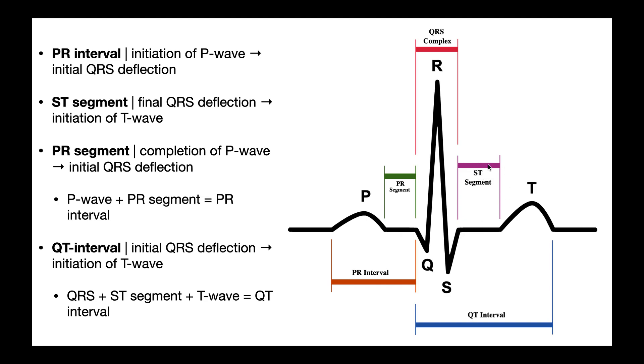Then we have in purple the ST segment. The ST segment starts at the final QRS deflection. So once this S deflects back upward right at the end of the QRS, that's the start of the ST segment. Then the end of the ST segment is basically right where the T wave starts. Sometimes where the T wave starts can be a little bit ambiguous, so the ST segment can be a little bit difficult to estimate, but it's from the end of the QRS right at the end of the S deflection upward to the start of the T wave.